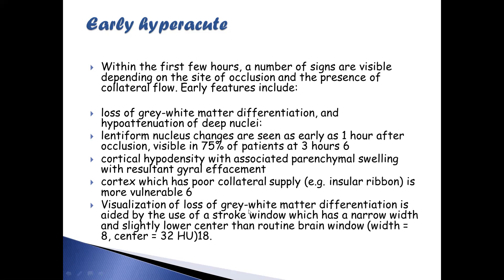If you want to look at the loss of gray-white matter differentiation, you need to use the stroke window, not the brain window. So in hyperacute infarction there will be loss of gray-white matter differentiation, cortical hypodensity, parenchymal swelling, and resultant sulcal effacement.